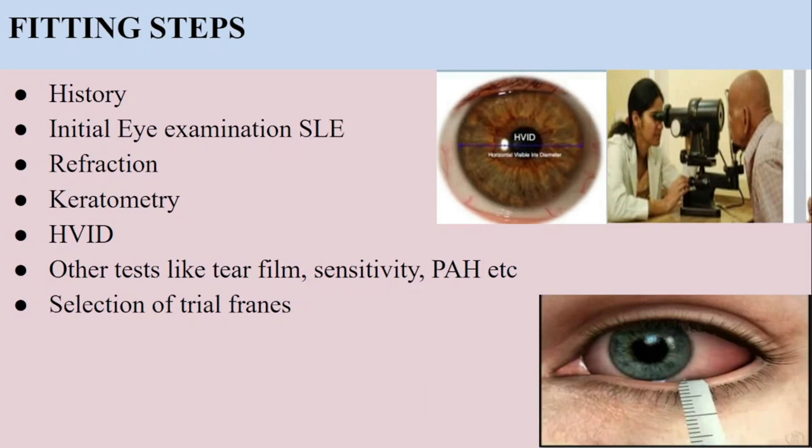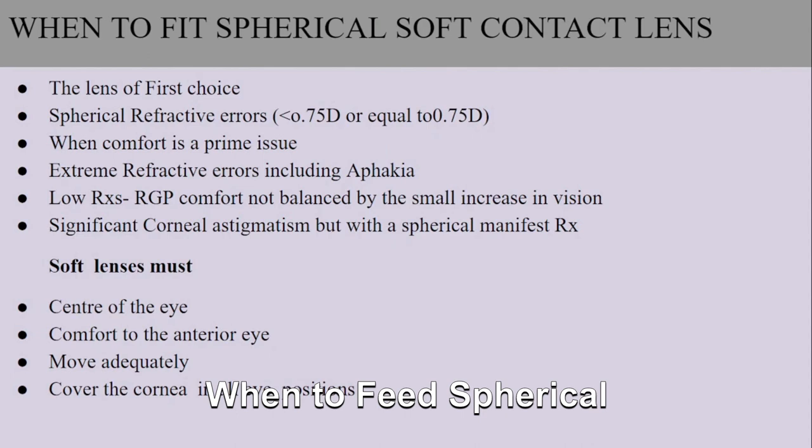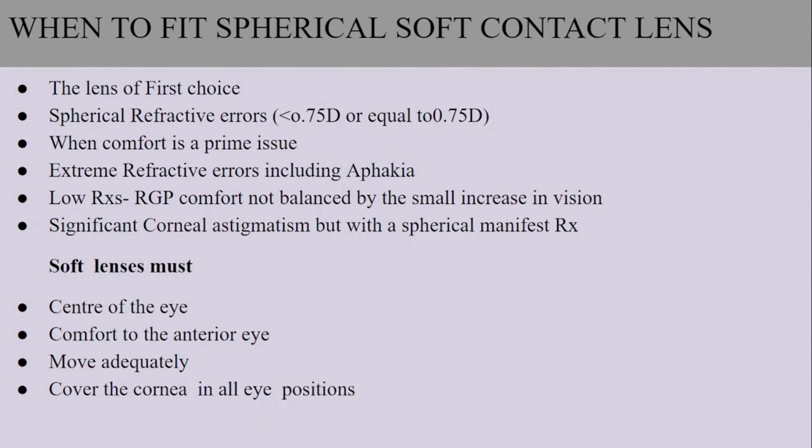By following this comprehensive process, your eye care professional can ensure a comfortable and precise fitting that promotes clear vision and maintains the health of your eyes. When to fit spherical soft contact lenses. Spherical soft contact lenses are a common choice for vision correction, and there are certain situations where they are the preferred option. Let's explain when spherical soft contact lenses are typically fitted.